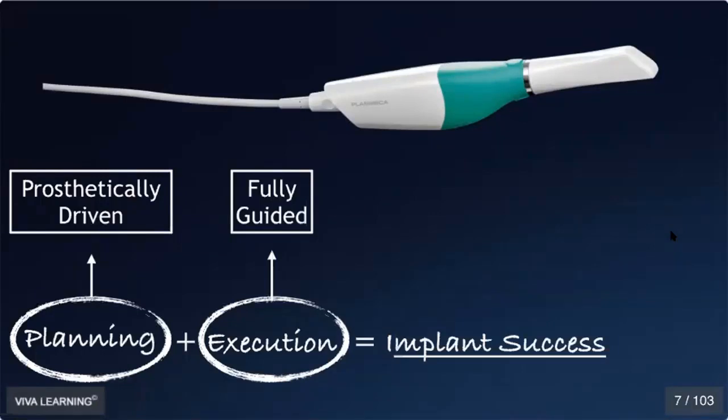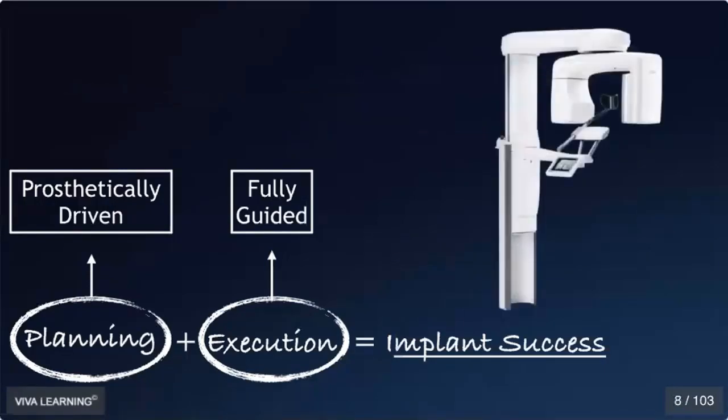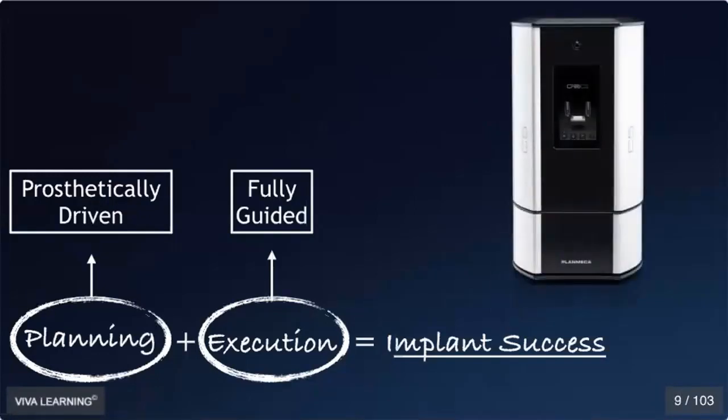I use the Emerald from Planmeca. We also need a high quality CBCT scan. This is the ProMax. Again, what we're looking for is just high quality diagnostic material that we can use. And finally, we have access as well to a really good 3D printer, and that's part of the equation as well.